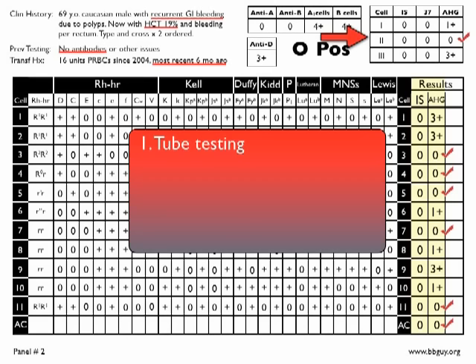The auto control is negative. That's good news. That's what we want to see. Next, let's look at how the reactions look. So we've got some 3+ reactions, we've got some 1+ reactions, you've got negative cells, so you have what I would call a variable pattern, and I hope you would agree with that.